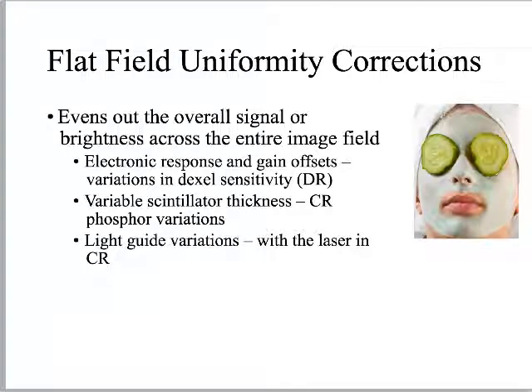All those noisy things, whether it's the dark noise or the dark current, or the Dexel dropout. We have a way of applying these algorithms to flatten that out, to get rid of those imperfections. So what it's going to do, using that algorithm I was just showing you, that like 5-sided dice thing, is look between them. It's going to say they should all be the same number, ideally. So how can I either offset the gain or the electronic response to make those all the same?